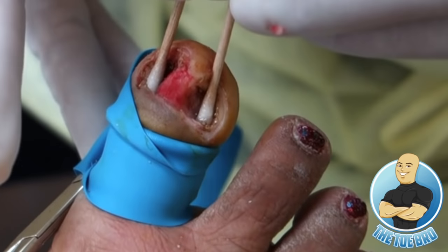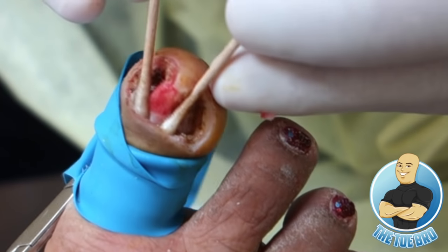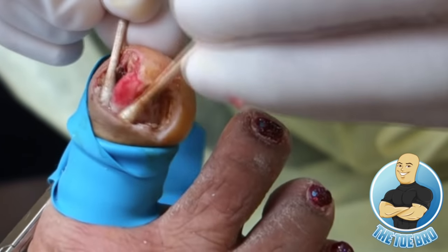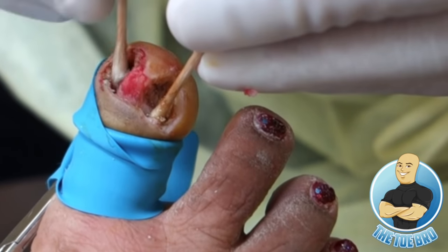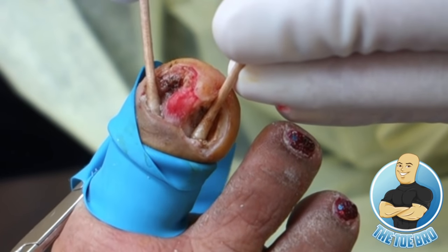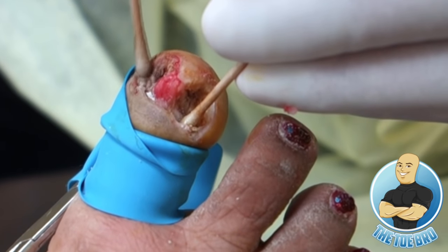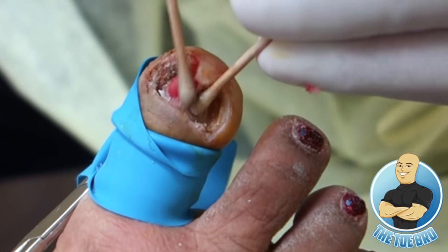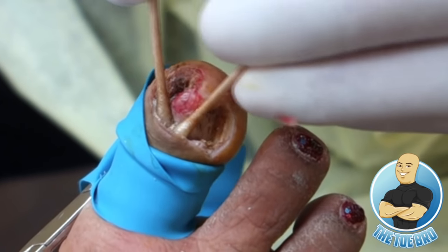If you guys have ever seen my other ingrown toenail surgeries, you'll know it's the exact same technique that I use during those procedures. I'm using a chemical called phenol that will kill the nail matrix and stop the nail from ever growing back. It will also damage any soft tissue that it comes in contact with. So I'm applying a layer over the warty tissue just to make sure nothing comes back after this treatment.